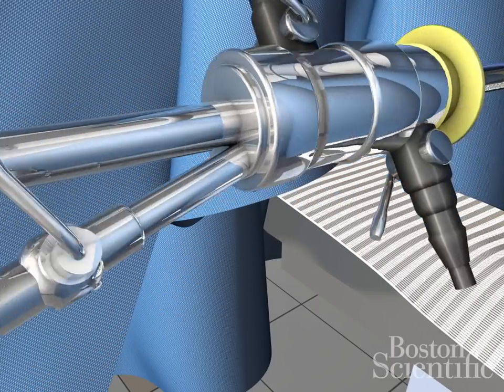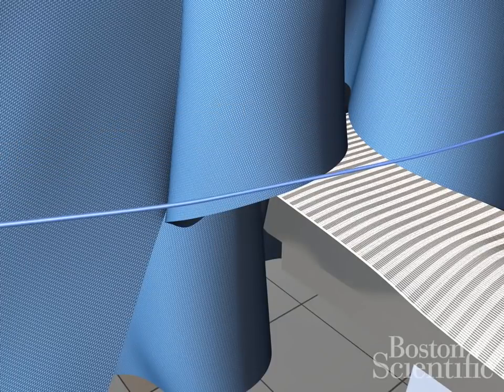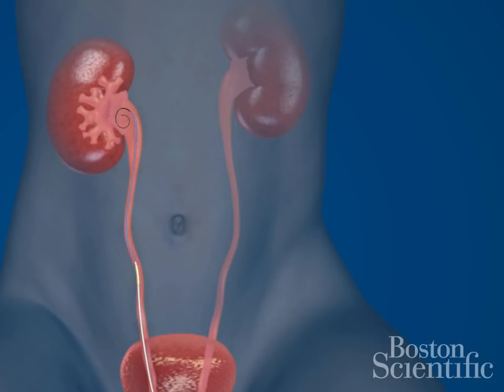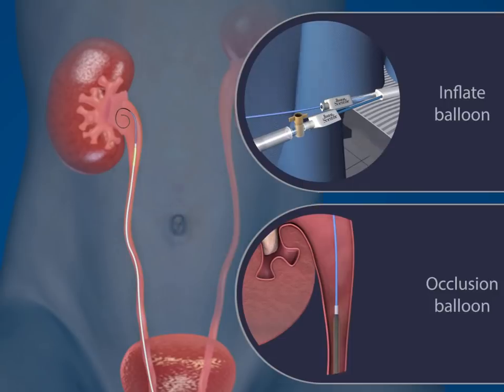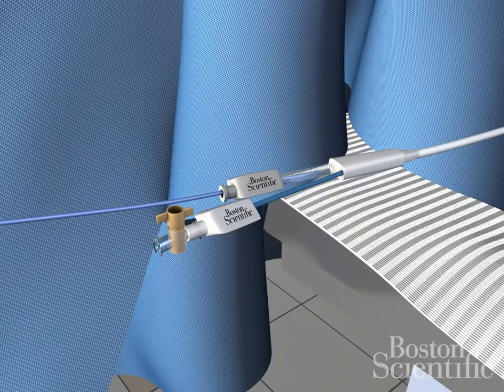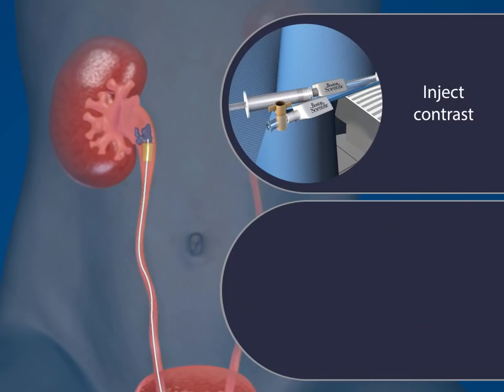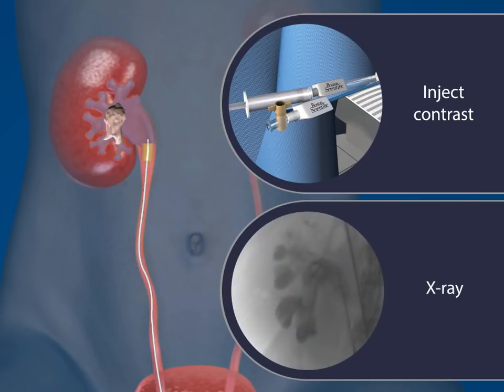The guide wire remains. Slide the occlusion balloon over the guide wire up to the ureteropelvic junction. Inflate the balloon through the lure lock connector. Remove the guide wire. Inject contrast material to confirm the location of the balloon and its occlusion of the ureter.